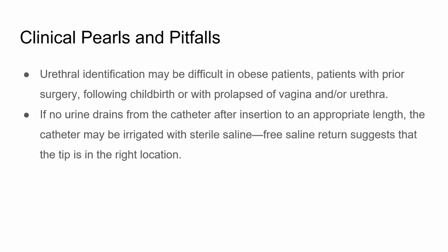Again, the pros and cons, the clinical pearls and the pitfalls of this particular procedure. Urethral identification may be difficult in obese patients, patients with prior surgery, following a childbirth, or with a prolapsed vagina or urethra. In such conditions, it will be difficult to identify the orifice.